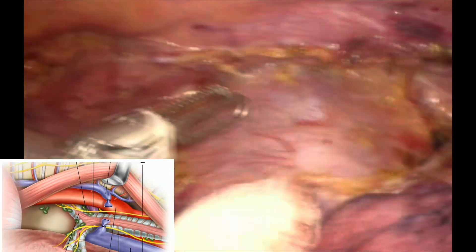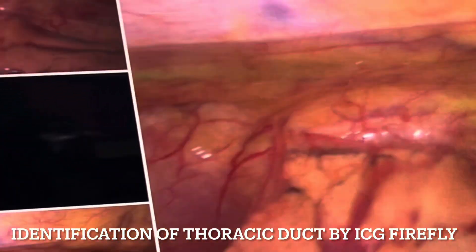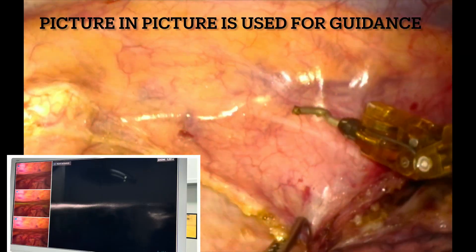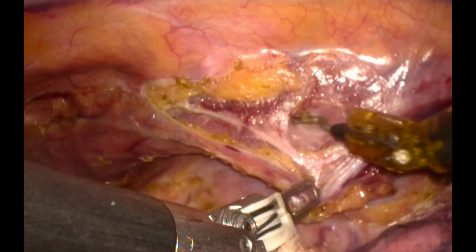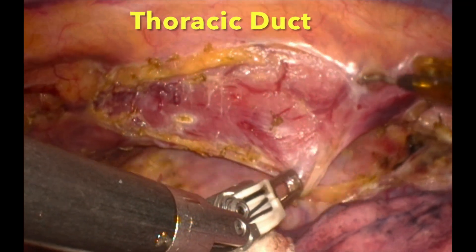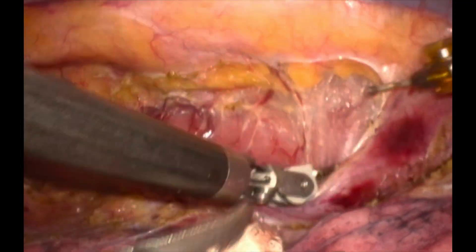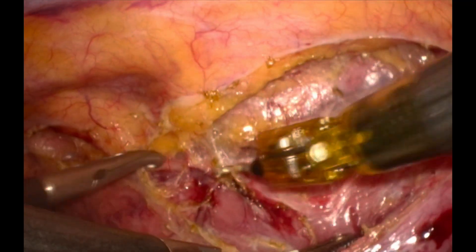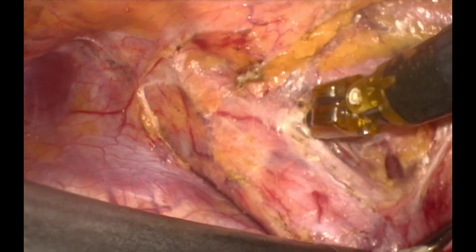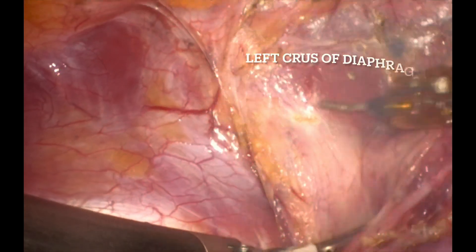We go to the posterior surface of the esophagus where we identify the thoracic duct using ICG technology. Generally we give preoperative ICG in the first web space between the toe and the second finger as well as the inguinal lymph node. Once the thoracic duct is identified, the mediastinal pleura is divided safeguarding the thoracic duct with gentle retraction on the esophagus. You can see clearly the avascular plane which is dissected with sharp dissection, and this dissection is continued inferiorly till you can see the left crus of the diaphragm.